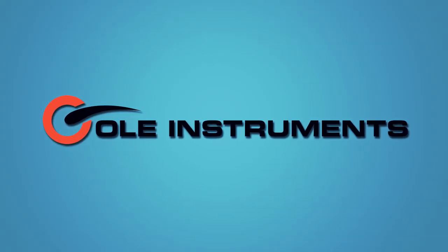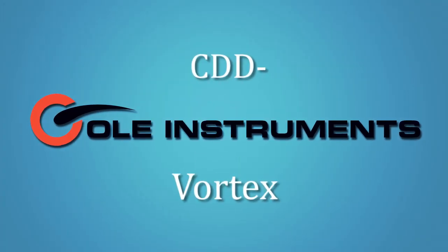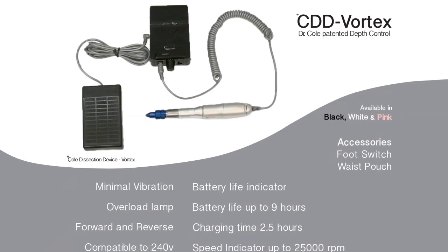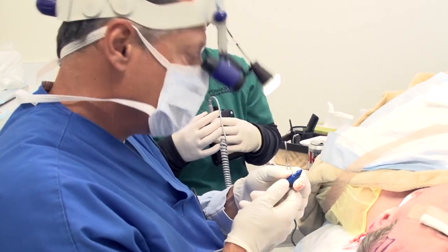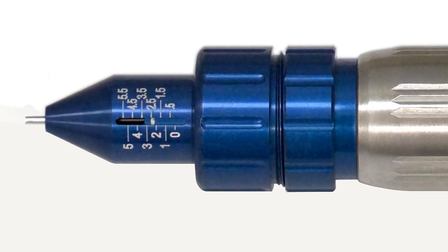Cole Instruments is proud to introduce the CDD Vortex, otherwise known as the Cole Dissection Device. Our new Vortex features Cole Instruments' patented depth control tip.